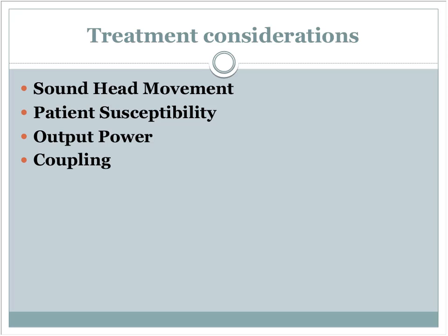I think the Vector Genesis does, but I know that the Transport 2 actually has a warming feature for the sound head. That's fine, because having the sound head warm doesn't decrease the effectiveness of the gel. The gel is going to warm up during the treatment anyway because it's going to pick up the body temperature. The sound head warming will probably speed that process up a little bit, but that will be a lot more comfortable for your patients. So it's okay to use the warming feature of the sound head.